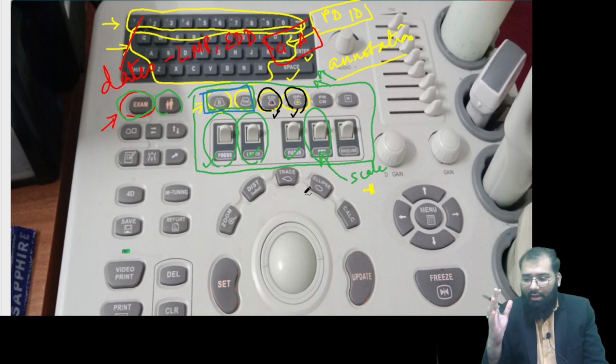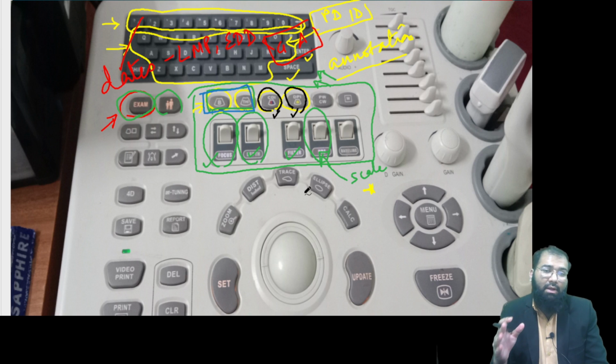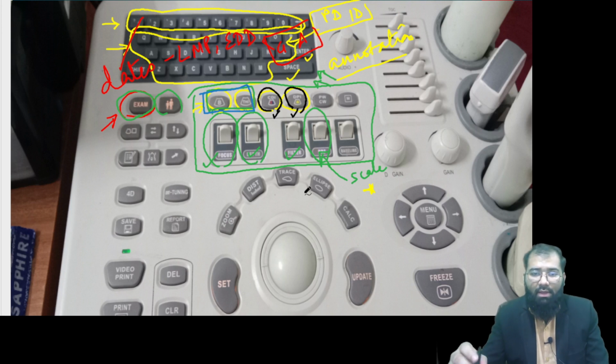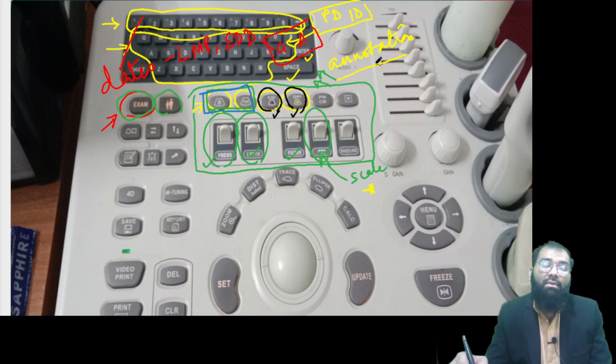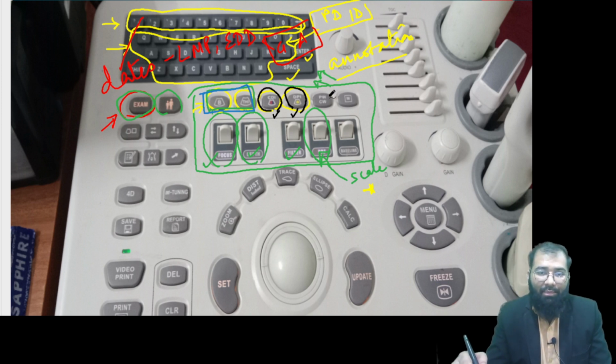Then one of the major differences is that in case of power Doppler, it is non-direction dependent. Power Doppler does not depend on direction, whereas in case of color Doppler, angles and directions are very, very important. Okay, so basically, this is just like scalars and vectors of physics, what we used to study in our 11th and 12th days.